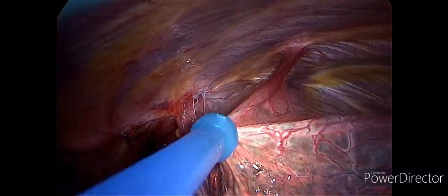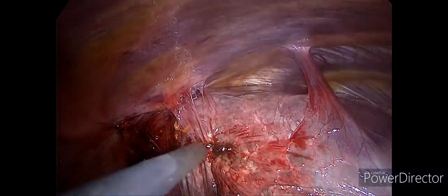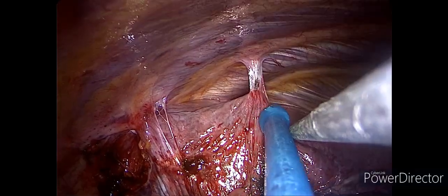As we rupture the bulla, we can now appreciate more band adhesions here and there, and all these will be taken down in order to mobilize the upper lobe and the bulla and start our resection.